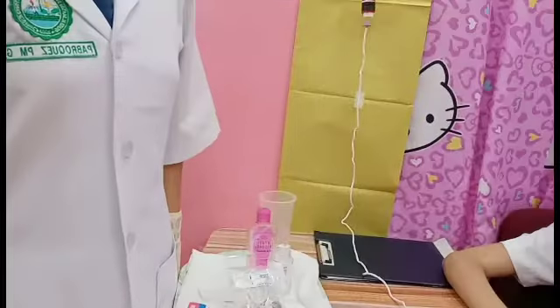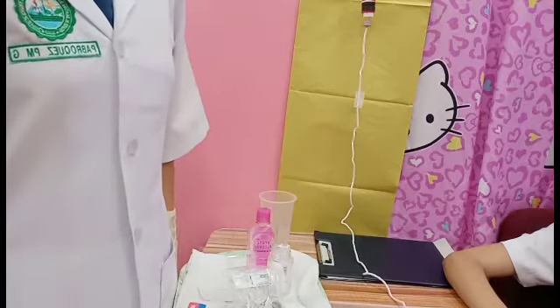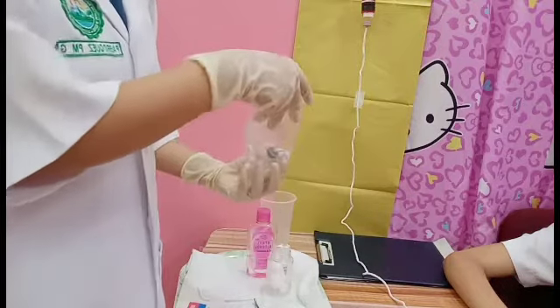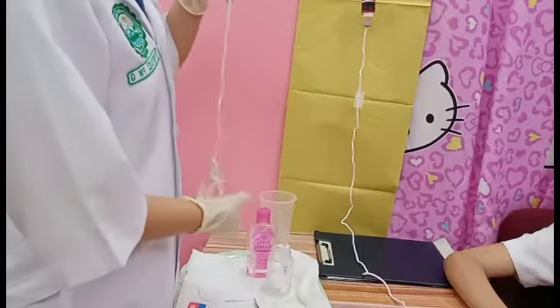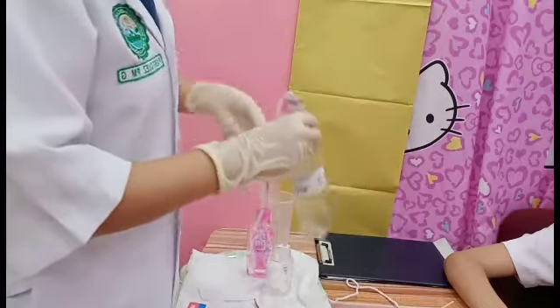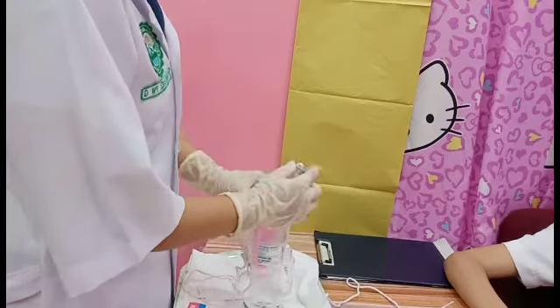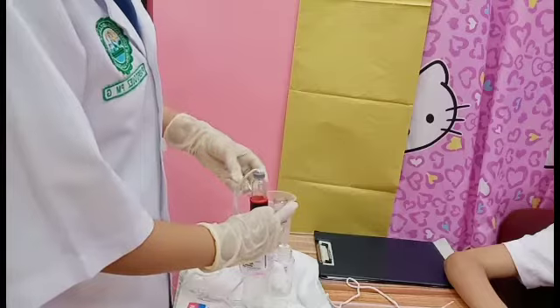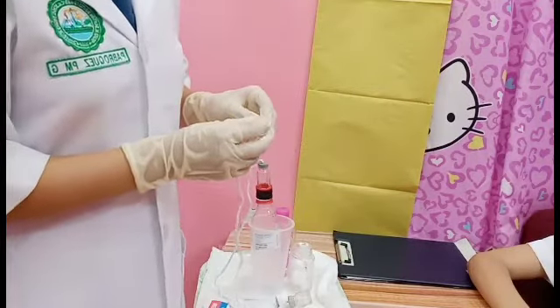Next is to open the administration set and remove protective covering from the infusion spike. Using sterile technique, insert into new container. Next, close clamp on new tubing.